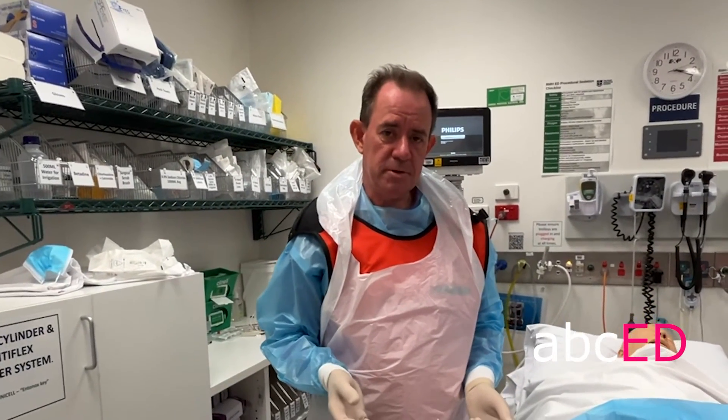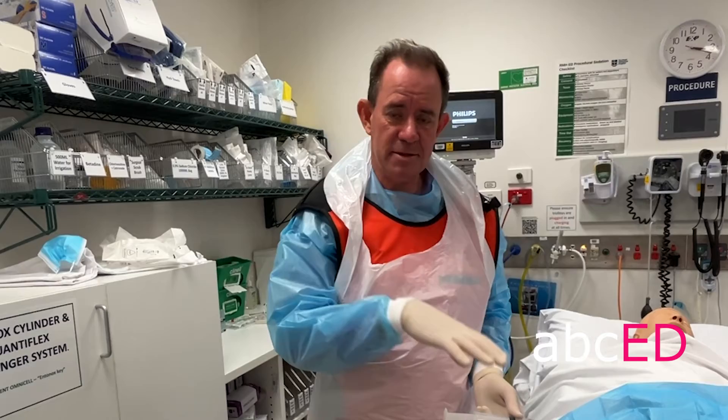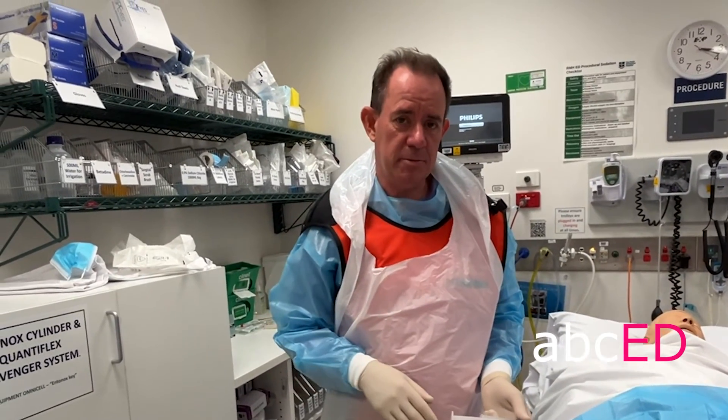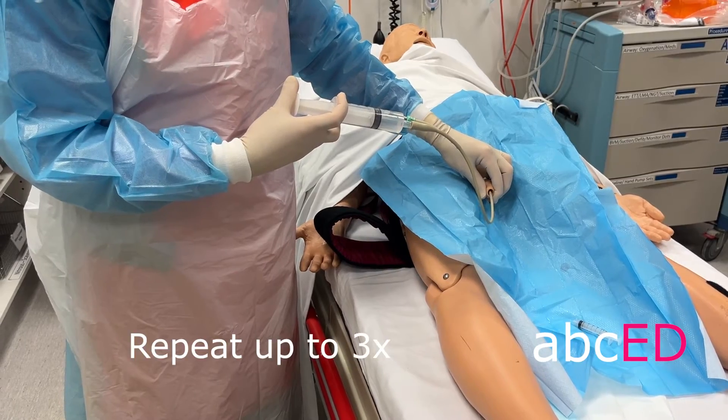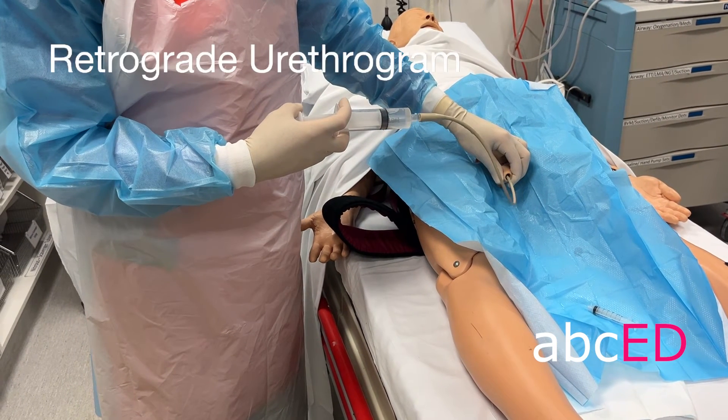Extravasation from urethral disruption will appear as a flame-like density outside the urethra. If the contrast doesn't enter the bladder, you'll have a complete urethral disruption. You may need to repeat this up to three times to get the optimal image.